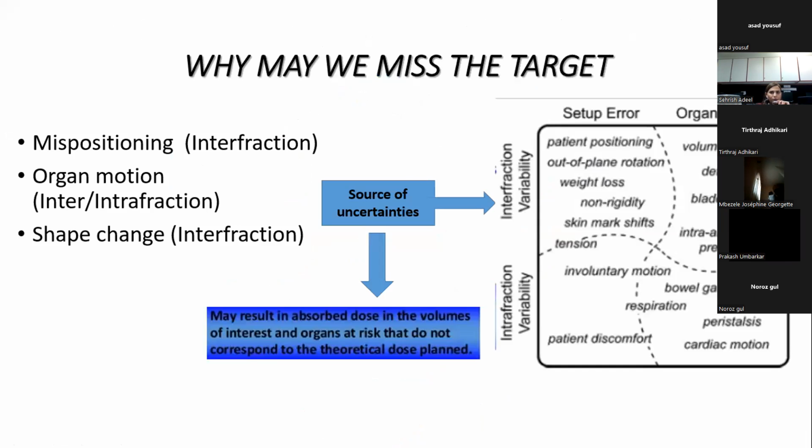So why do we miss the target? Because there can be many errors during the planning process or during the treatment delivery. They can be mispositioning. They can be the organ motion in the form of interfraction or intrafraction, the change in the shape of the organs.